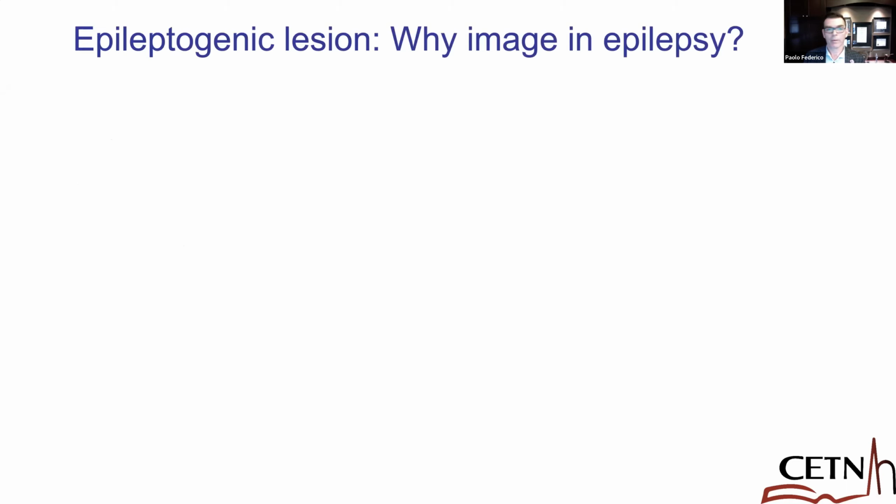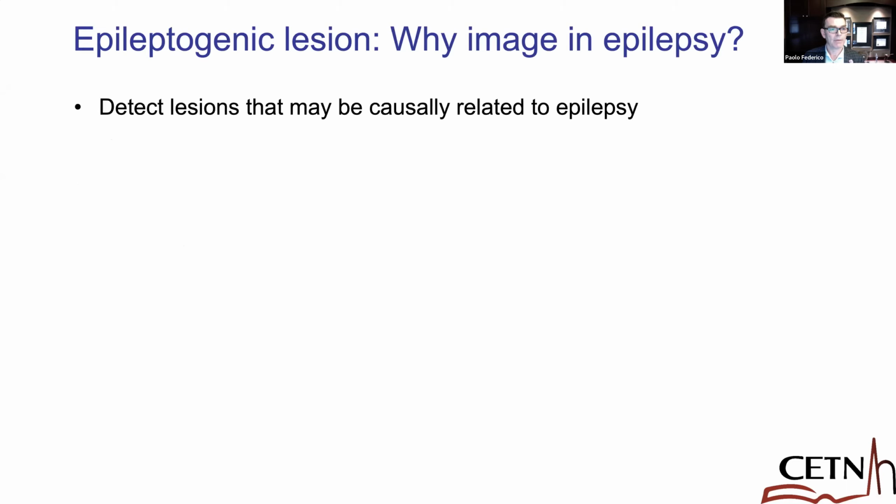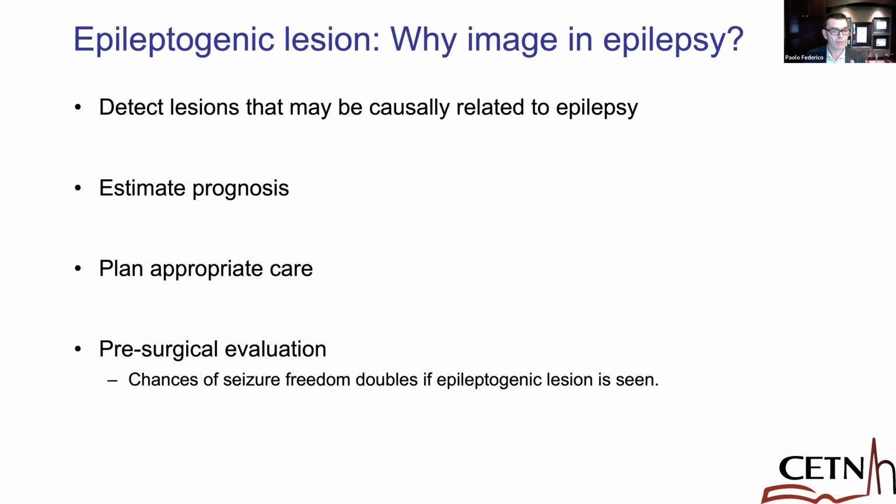So why image in epilepsy? It's important to do so to detect lesions that may be causally related to epilepsy, estimate prognosis, plan appropriate care, and for pre-surgical evaluation.